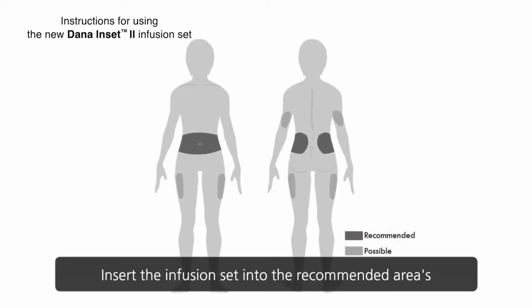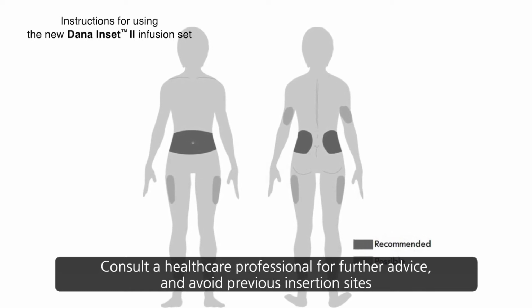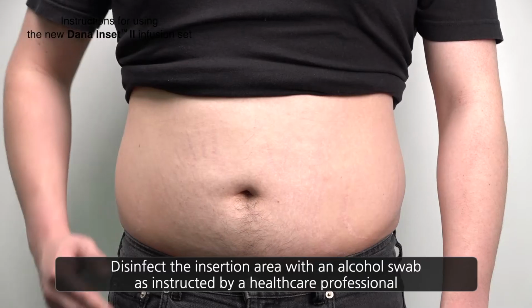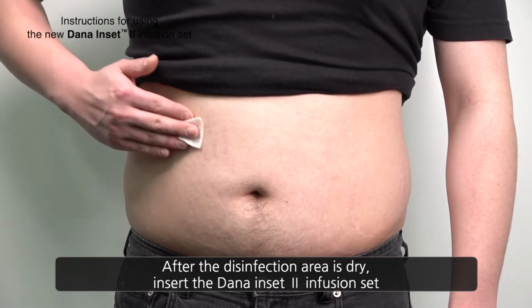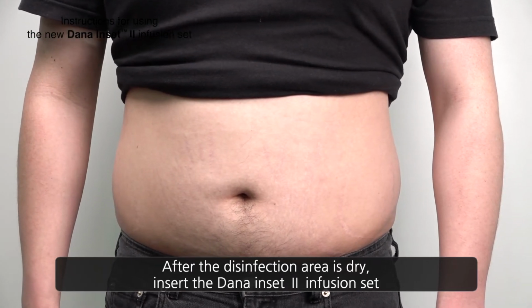Insert the infusion set into the recommended areas. Consult with a healthcare professional for further advice, and avoid areas near and around previous insertion sites. Disinfect the insertion area with an alcohol swab, as instructed by a healthcare professional. After the disinfected area is dry, insert the Dana Inset II infusion set.